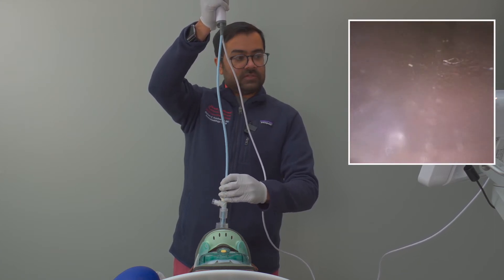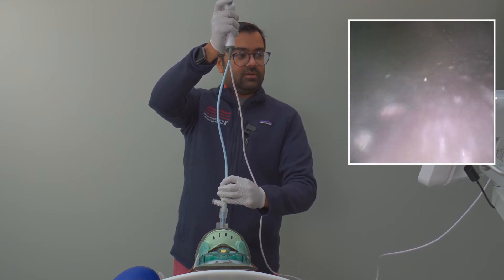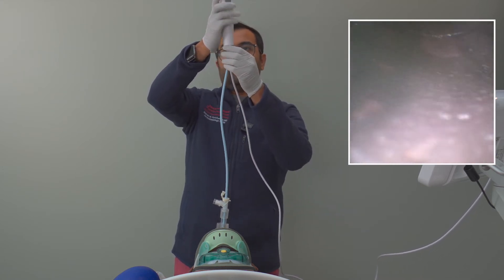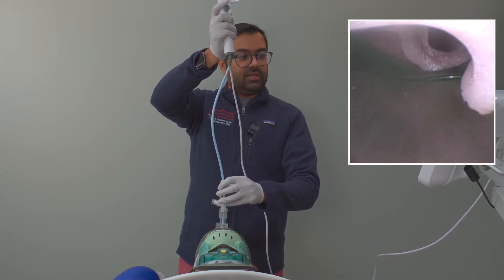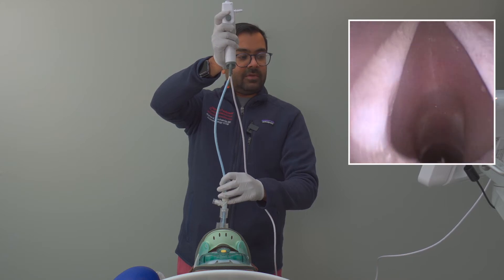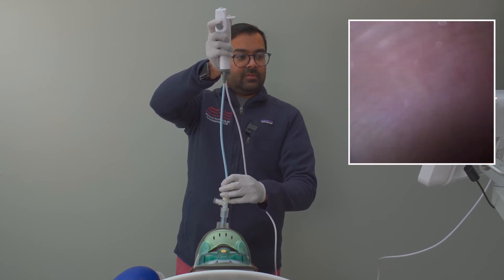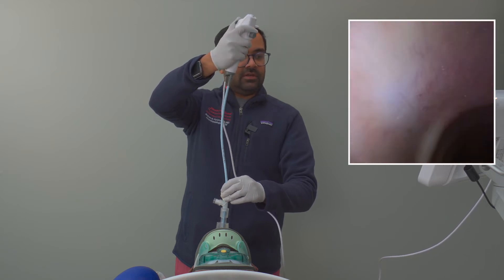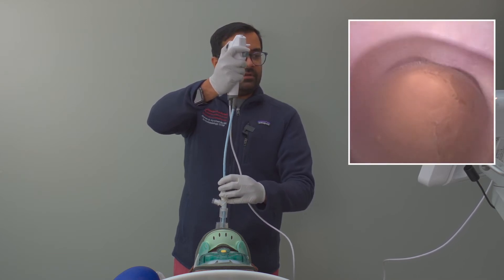Let's go ahead and insert the Aintree. We're going through the supraglottic airway here, and I want to make sure that our bronchoscope shaft is completely straight so that whatever I do at the controller up top is translated at the tip below. You can see the epiglottis, and we see the vocal cords — the glottic orifice. I'm going to navigate the bronchoscope subglottic, and make sure that the Aintree catheter follows the bronchoscope as one unit. Advance further until we're just right above the carina.